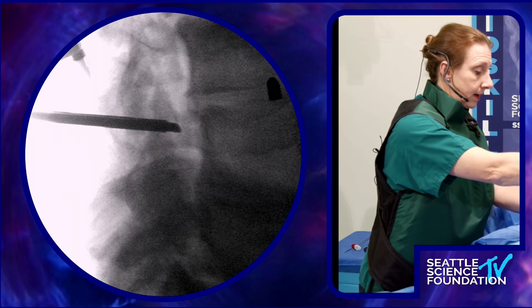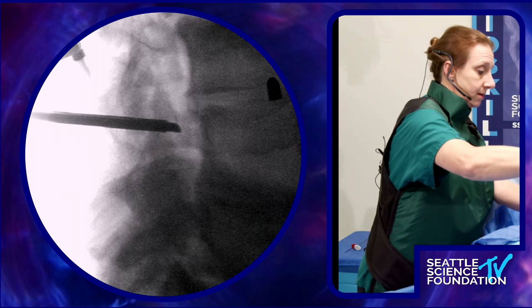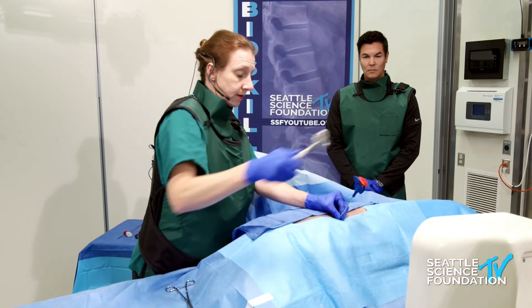I'm going to turn my bevel laterally because it looks like I'm moving medial faster than I'm moving anterior.